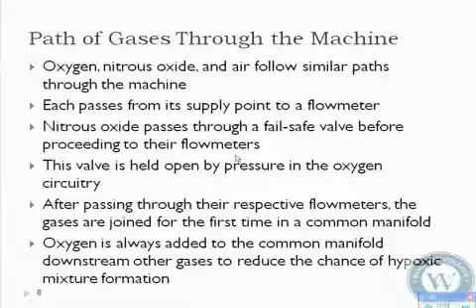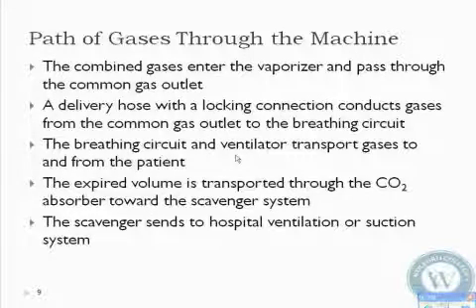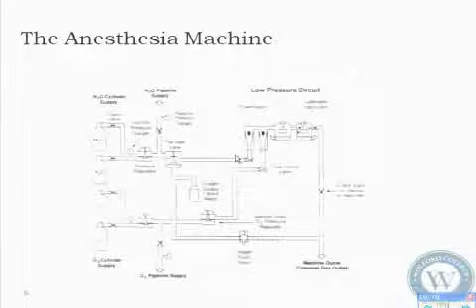I would definitely get to know the way your gases travel. Everything I'm telling you today is practical stuff, relevant to what we do every day, and it's testable. You need to know how machines work and how they can fail. I just explained all of this, so I don't need to read it again, but make sure you look back over it, because it's just the explanation.